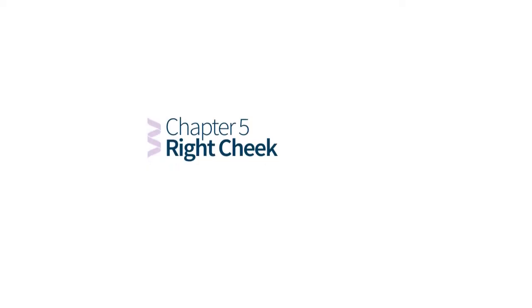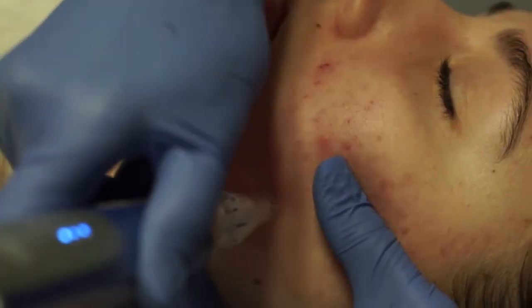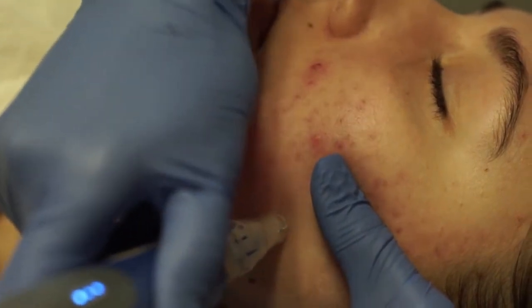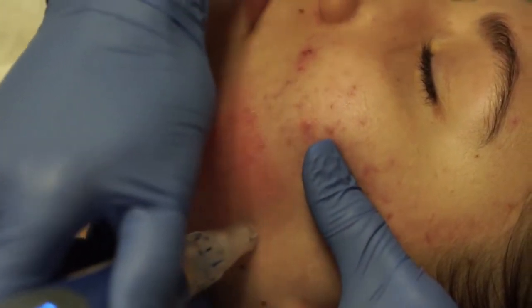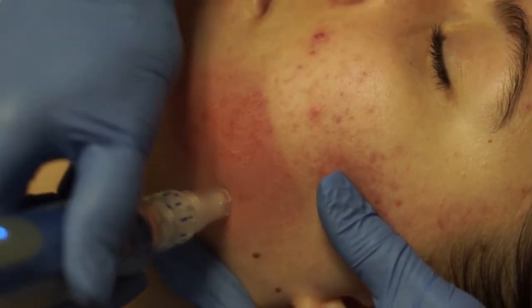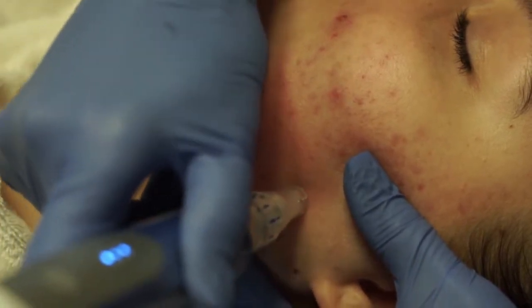Right cheek continued. Continue to treat the right cheek, section by section, holding the skin taut and moving in a horizontal path, then overlapping in a vertical path, then making tiny, slow, circular motions. The SkinPen Precision device allows for incremental increase in settings to allow for the variability in thickness of healthy skin and acne scar tissue.